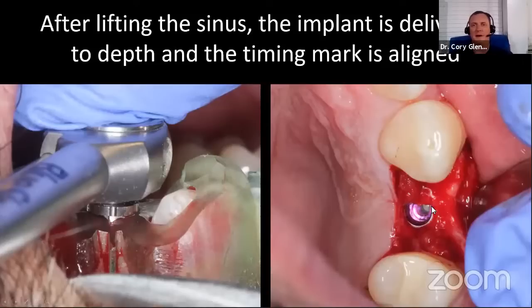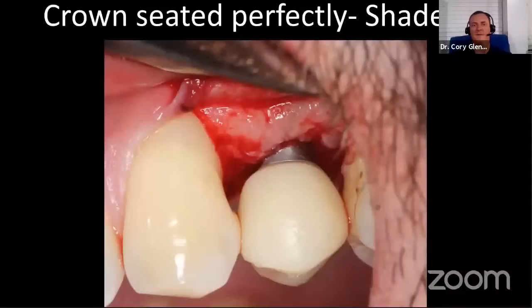Now, again, in theory, if everything was accurate, we should be able to take the pre-made final restoration and it should just drop into place and torque all the way in. And sure enough, it did. And I didn't even take a shade on this guy. Again, everyone in my office, or my lab, I guess you'd say, is an A2. And thankfully he was an A2. So it worked out great, because otherwise he was going to have a mismatched tooth, but he wouldn't have cared.